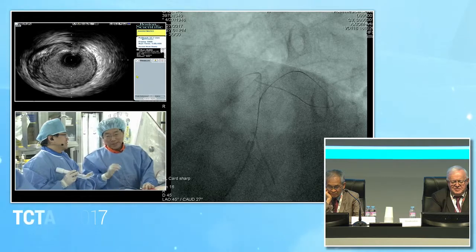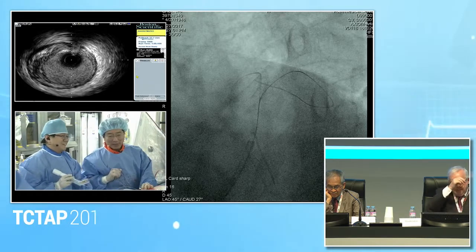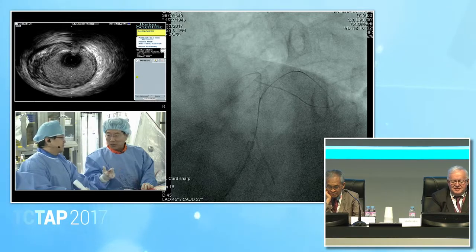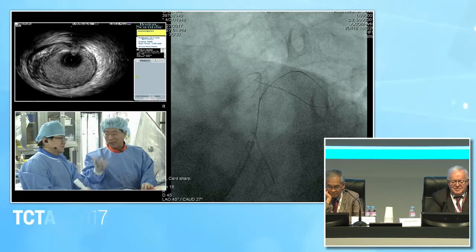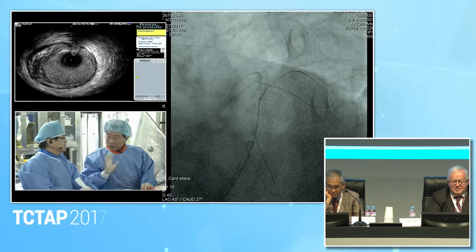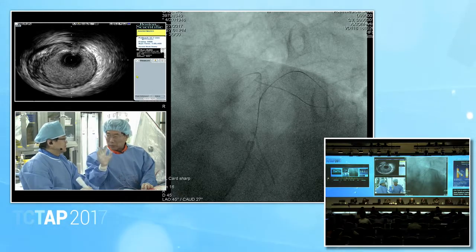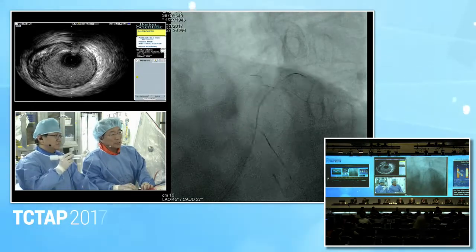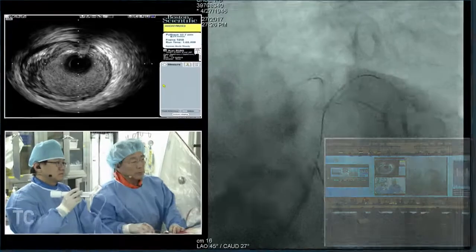Lubat, you may not agree about that. However, for different stent techniques, including the culotte, mini crush, and TAP, I don't believe there is much difference in immediate outcomes, or in clinical outcomes.